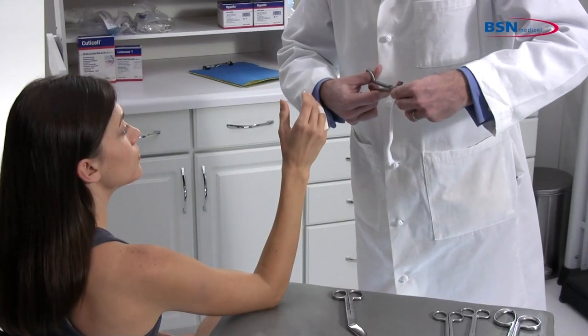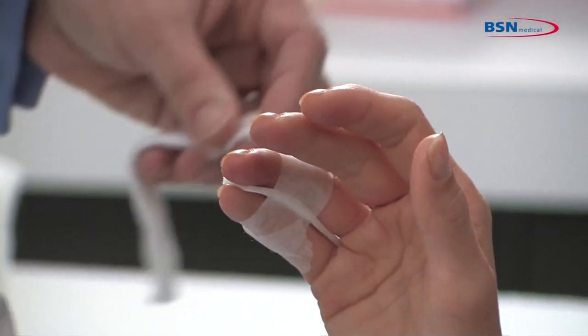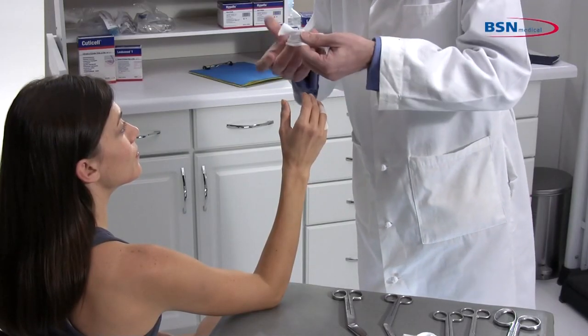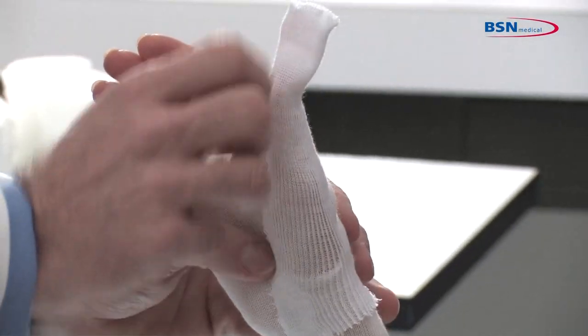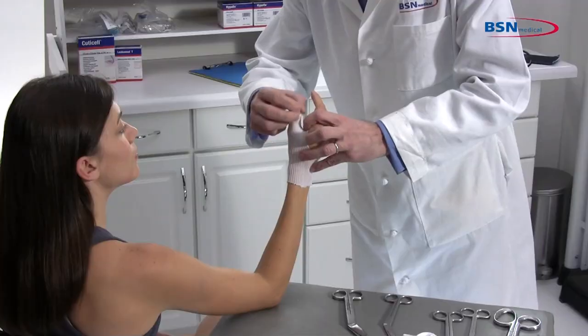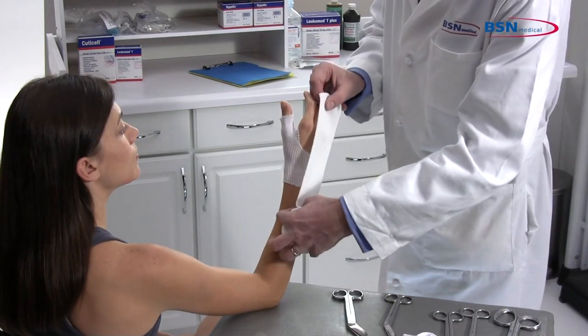Measure with a one-inch stockinette length to protect the thumb area. Make a one-half-inch cut at one-third of the length. Slide the stockinette over the wrist and apply the other part over the thumb for protection. Another option is to measure the length and make a cut to slide over the thumb. Select a stockinette that will not be restrictive at the widest part of the limb.